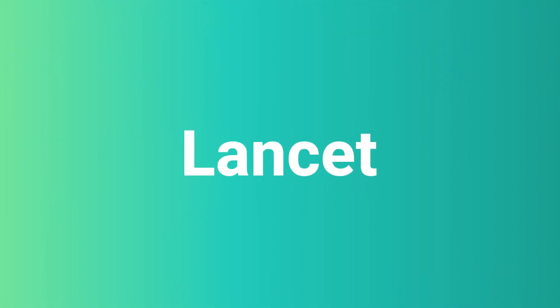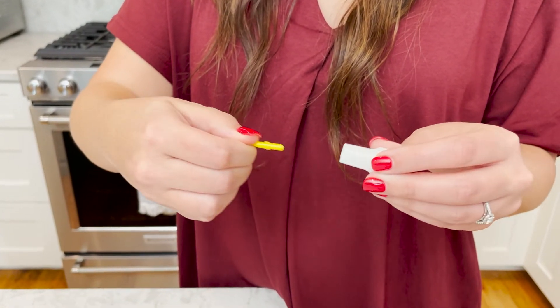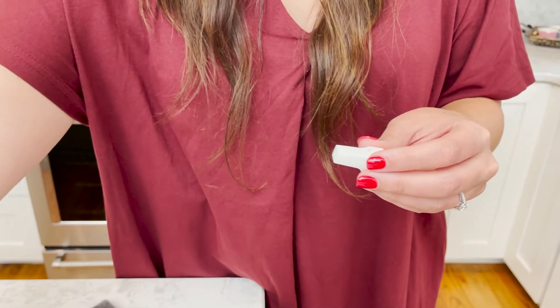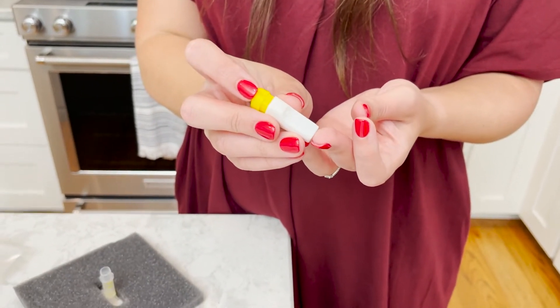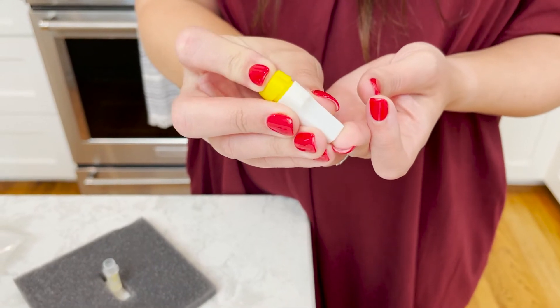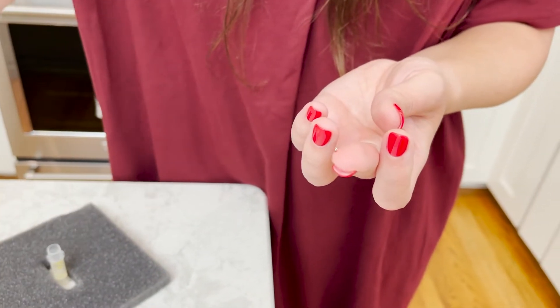Step 4: Lancet. Twist and pull off the thin yellow tip of the lancet — for one use only. Avoid the nail bed. Press the white end of the lancet onto the side of your middle or ring finger until it clicks.